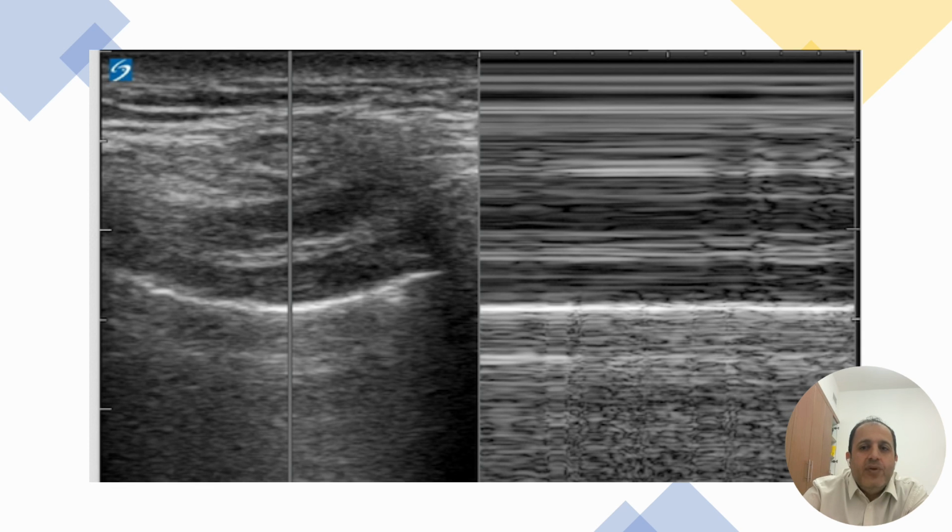It's a pneumothorax case. And you can use M mode. If there is no lung sliding, use the M mode. We should have the seashore sign. It's like a C, and it's a shore. So we should have the seashore sign. If you put the M line on the pleura, and if you see something like that, where all of it is like a barcode sign, it's a pneumothorax.